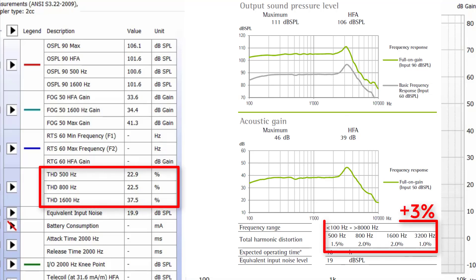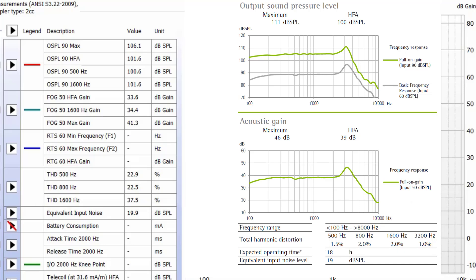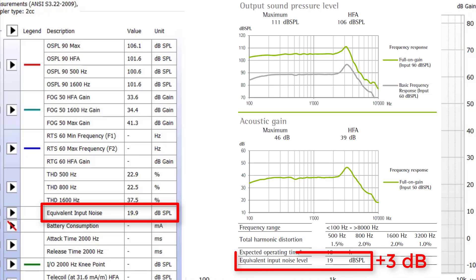Where things get really concerning is when we look at the distortion levels of the hearing aid. The spec sheets indicate we should be no higher than 4.5 to 5% distortion at 500, 800, and 1600 hertz. We can clearly see that we are exceeding those ranges with distortion percentages of 22.9%, 22.5%, and 37.5% respectively. Even though the equivalent input noise — the amount of noise a hearing aid generates when turned on — is within manufacturer specifications at 19.9 dB SPL, the diagnostic tests clearly indicate that this hearing aid is not functioning properly.